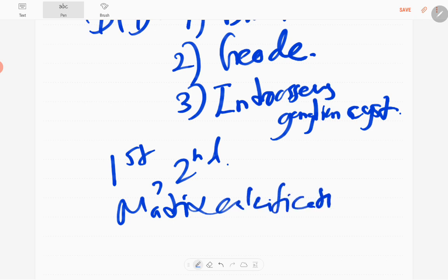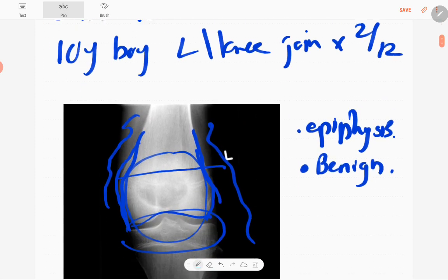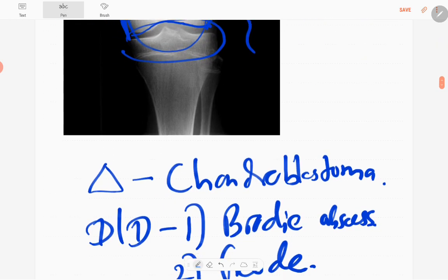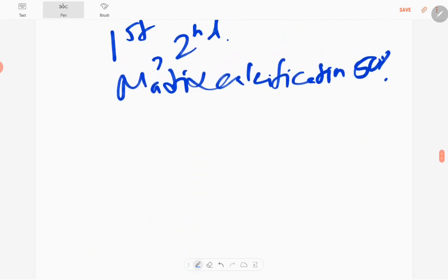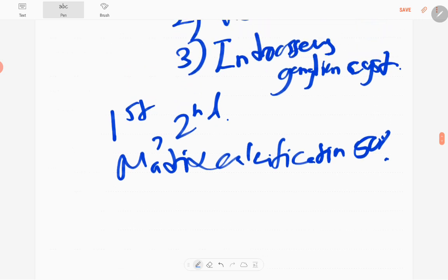In fifty percent of patients. Here you can't see definite matrix calcification. Those are the few cardinal features of chondroblastomas.